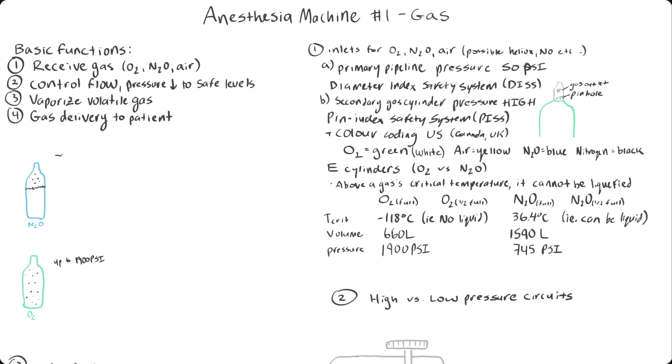So when you measure the pressure coming off of this tank, it will be 745 psi. Even when you start using up this liquid form, so it will turn into gas and drops the level, then all of this space will be gas.